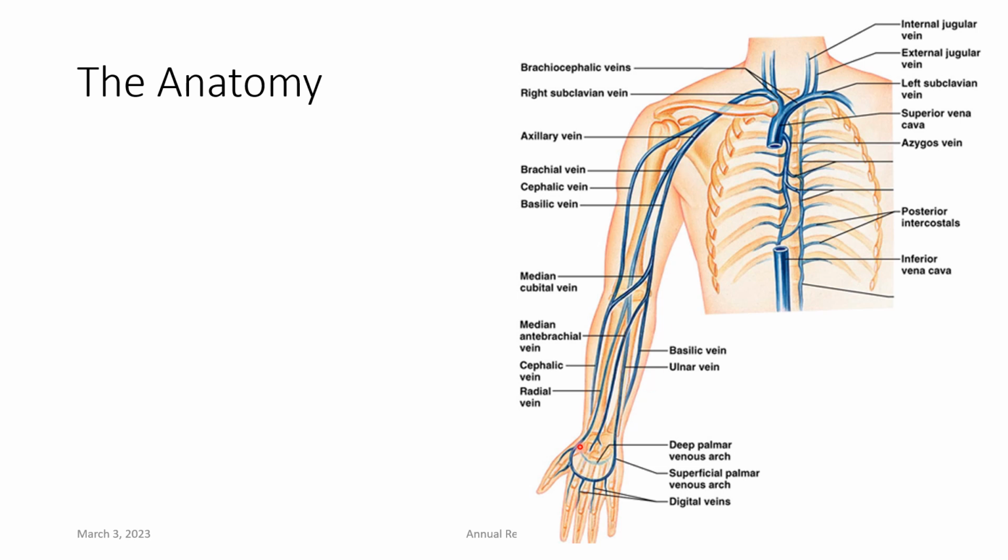Okay, now on the radial side of our arm, or the lateral side of our arm, we followed that cephalic vein all the way up. It mixed a little blood here in the median cubital vein, but then it continued up at the lateral aspect of our arm. And when it finally comes in and meets with that axillary vein, then we refer to it as the subclavian vein.